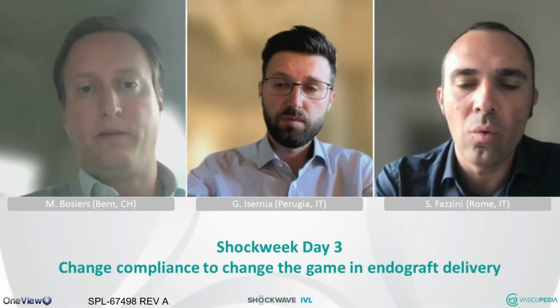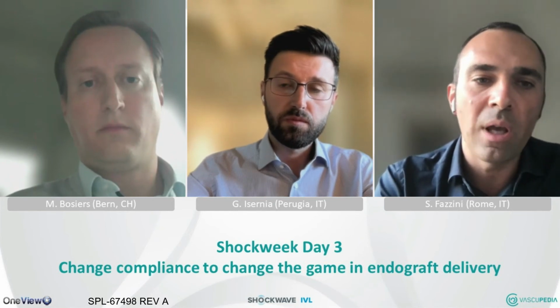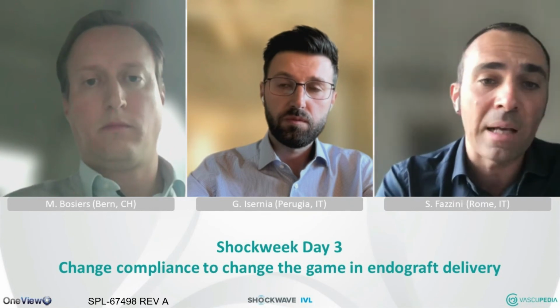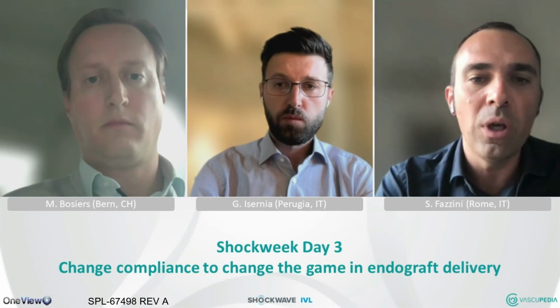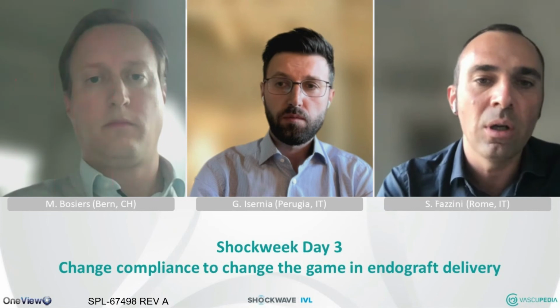Yeah, I like Giacomo. I didn't have any open conduits, and I agree. So we should consider the presence of calcium or not. We could also have women, for example, with small access but without calcium. So it's a totally different story. In this case, we cannot solve anything with the IVL. So we should use IVL in the presence of severe calcification.